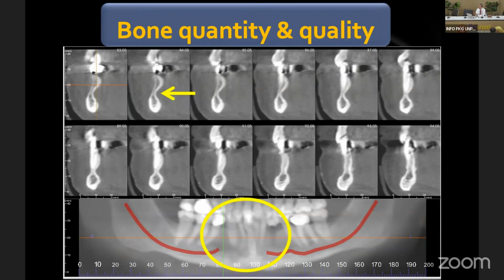Without cone beam, it's hard to see this kind of change. In the old days, when people placed dental implants there, you saw a lot of lingual perforation because of not seeing this kind of concavity inside the mandible.